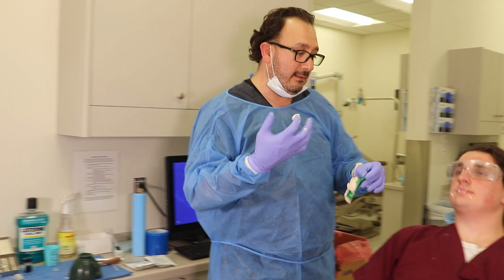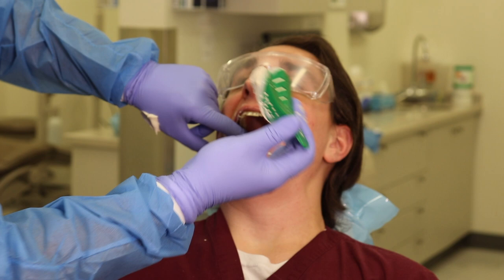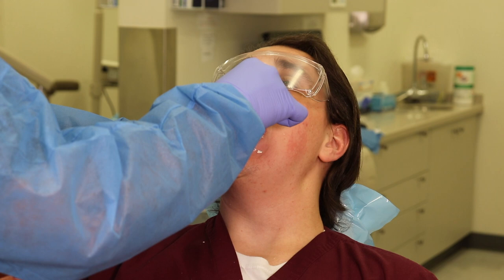Again, I take a little bit of alginate, rub it on the occlusals. I can use the mirror or I can use my finger. Okay, I do this, I set it. Once I set it, I go from the back. Once I set the back, I roll it towards the front.